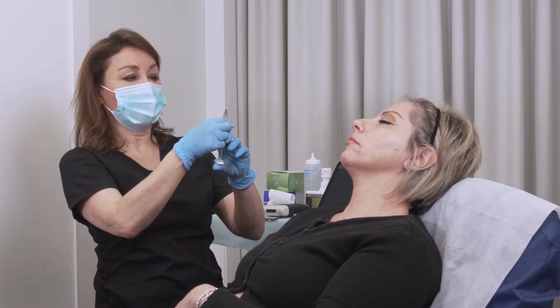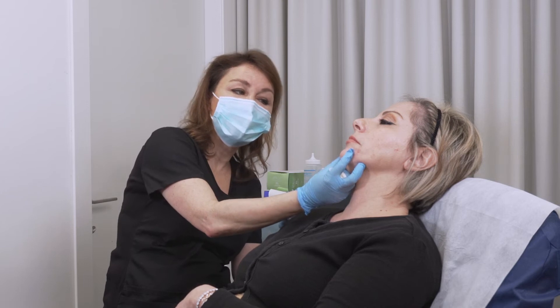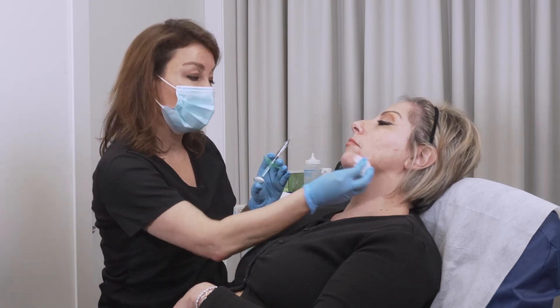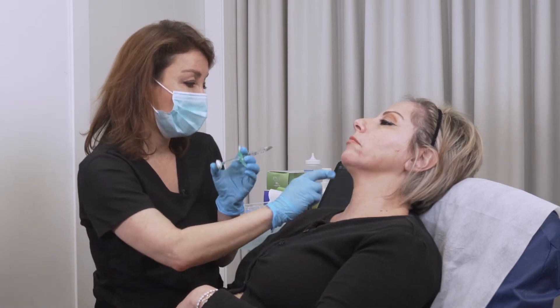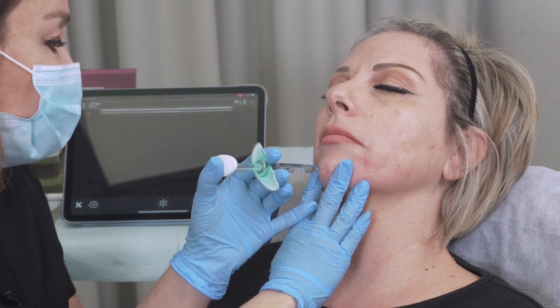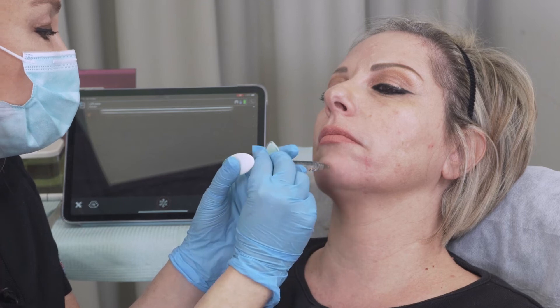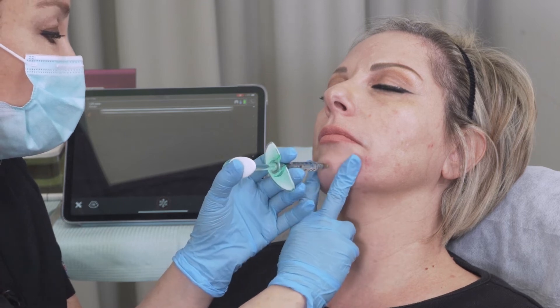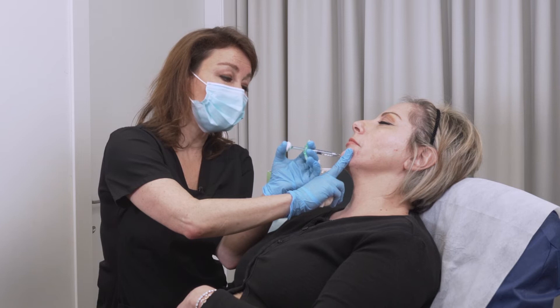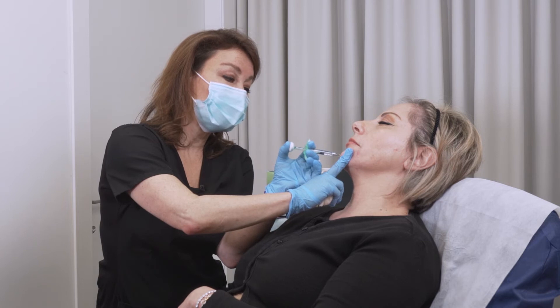What I will do is inject at the bone to get a little bit more chin projection in her case — she can really benefit from a little more chin. I'll go into her chin where I would like to get more projection. I can aspirate just a little bit, there is nothing there, so I will go on and inject. It's very important to inject slowly and not to build up too much pressure in the tissue.